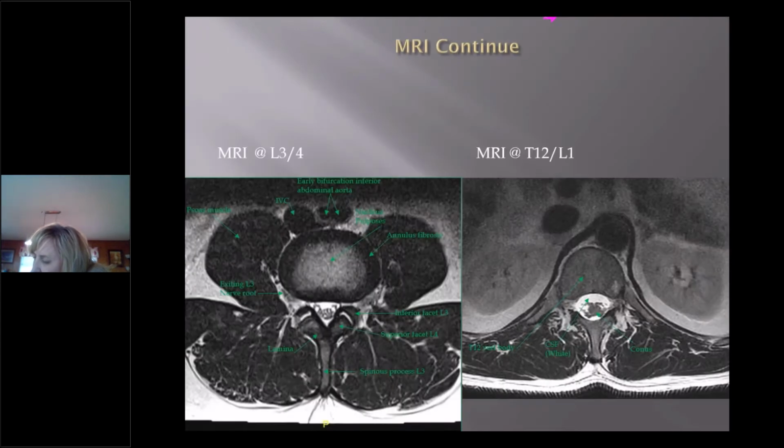We can actually see the kidneys here. We can see part of the right kidney, or excuse me, left kidney and right kidney, and again the great vessels. And this is actually part of the diaphragm. We're looking down on top of the diaphragm as it makes its cut. So just a few things that you can see on the MRI. And again, this just happens to be one of many applications.